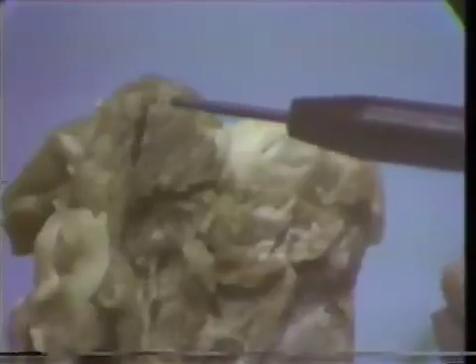As I make an incision, I will take my time and make a cut slowly in the hog jaw. As we can see along the sides of this cut, the tissue is severely singed, and there is much damage to the surrounding tissue caused by overheating from the unit.